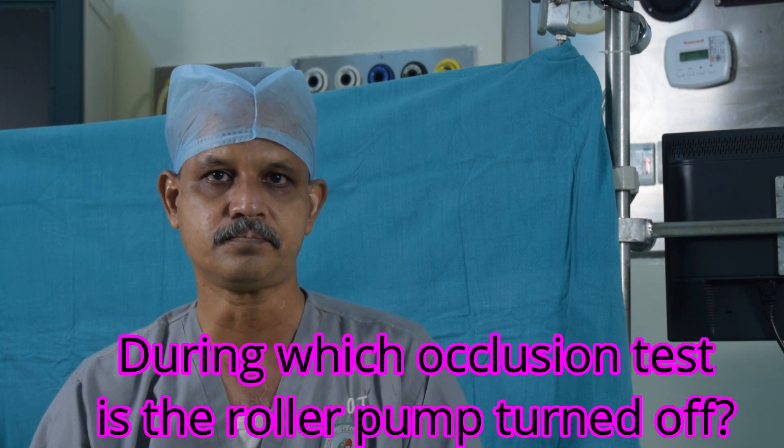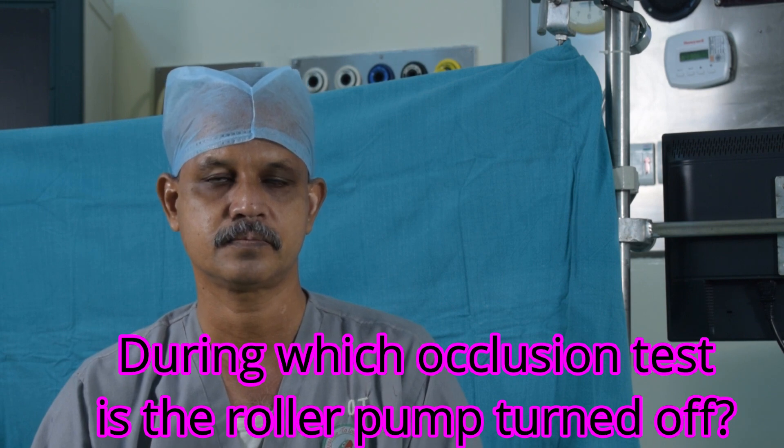Of the three occlusion tests, in which does the pump remain off? The pump remains off in the first and the third cases — that is, the meniscus fall method and the pressure fall method. In the dynamic method, the pump is rolling at 5 to 8 RPMs. In the free fall method and the pressure fall method, the pump is stopped. In the pressure fall method, you generate pressure to about 300, then the pump is stopped.